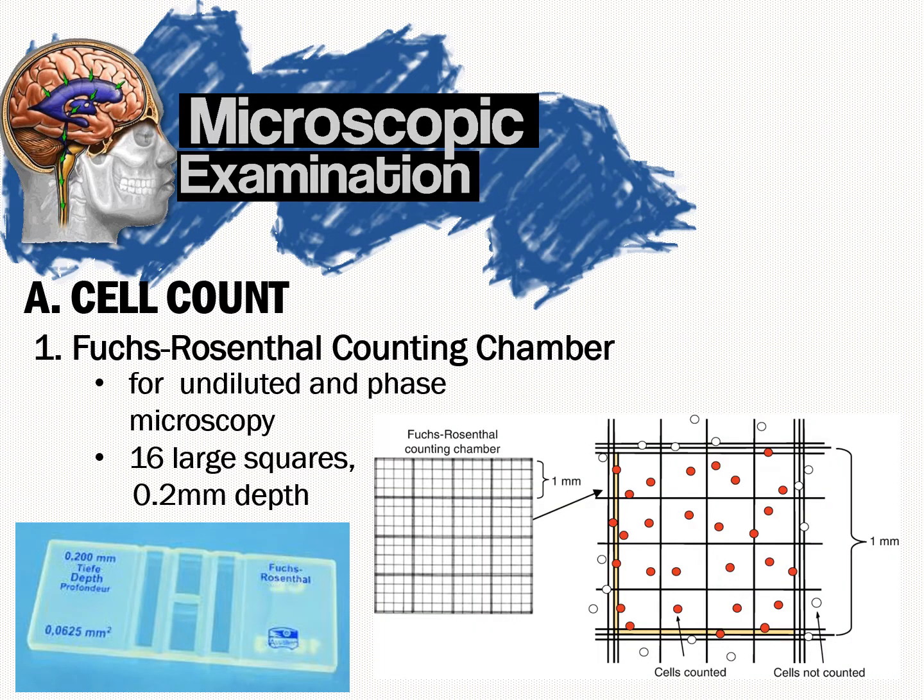Let's proceed to the microscopic examination of CSF. The first exam or test is a cell count. For cell count, the routinely performed one is a WBC count. RBC count is only done when a traumatic tap has occurred or a correction for leukocyte or protein is needed. The normal WBC count is 0 to 5 per microliter for adult, and this number could actually go higher in children. For newborn, 0 to 30 mononuclear cells per microliter is normal.